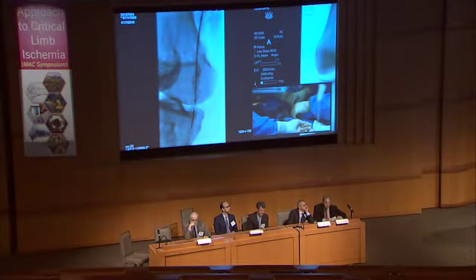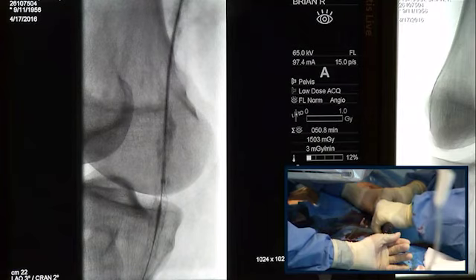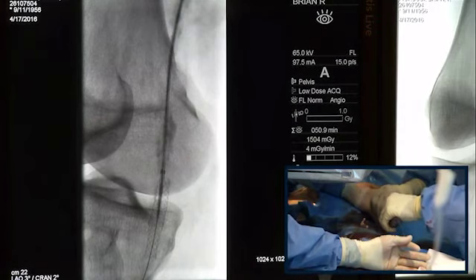A lot of resistance, as we thought. Hold it here. Don't hold it there, because you hold my stent. So I'm taking my time. There is no reason to rush here. You've got to take your time with this stent and try to do a good job.